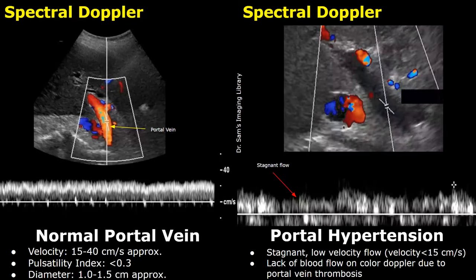Here is another case of portal hypertension showing stagnant low velocity flow. On color Doppler we cannot even see the Doppler signals because the flow is very slow — much less than 15 centimeters per second. There is also portal vein thrombosis in this image.